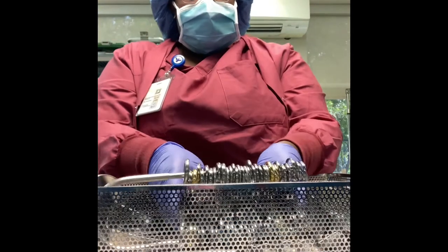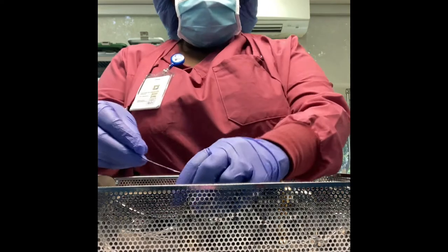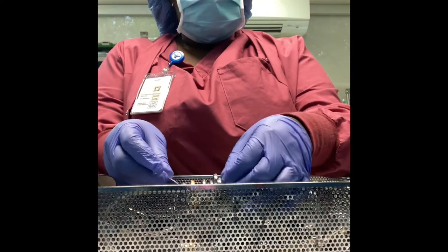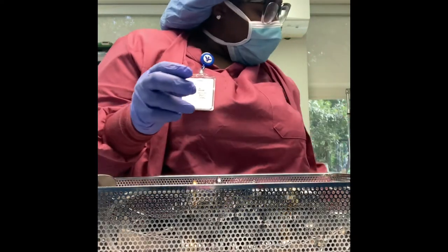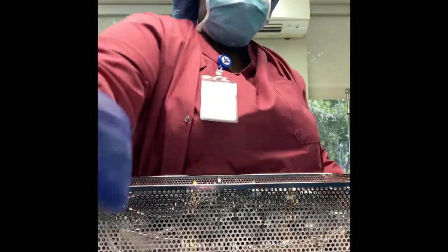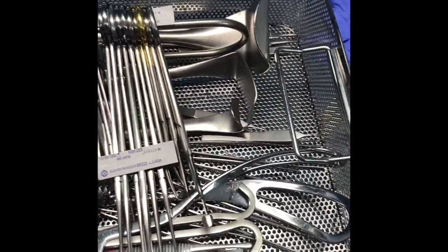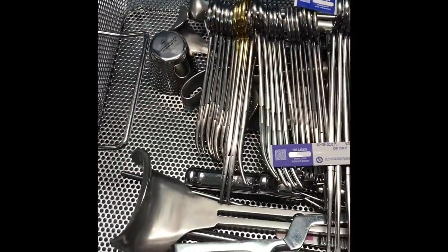Now that I'm finished with the tray, we're going to put the scissors on top, and then we cannot forget our indicator — if we do not put the indicator it is considered not sterile. The tray is nice and neat and ready to be packaged.